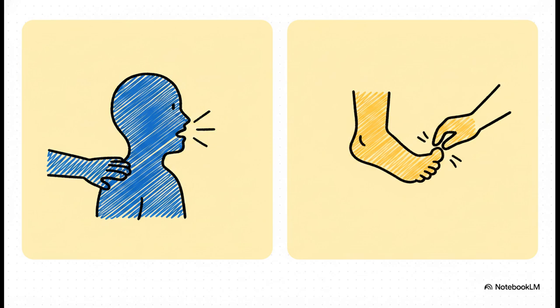All right, so once you know the scene is safe, we use an if-then protocol to check for responsiveness. Basically, we want to physically stimulate the patient. We definitely want to avoid doing unnecessary chest compressions on someone who might just be taking a nap. For an adult, you're going to go right to the shoulder, tap firmly, and shout super loudly, "Hey, are you okay?" You shout just in case they're deaf, and you tap to provide that physical stimulation.